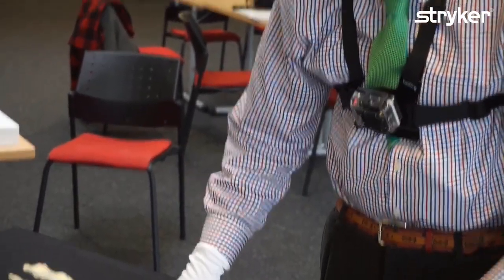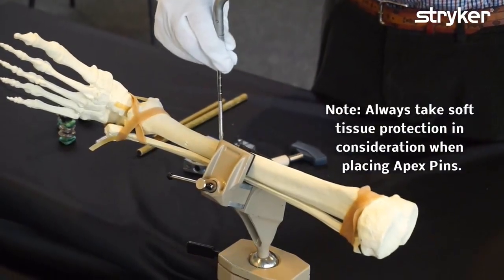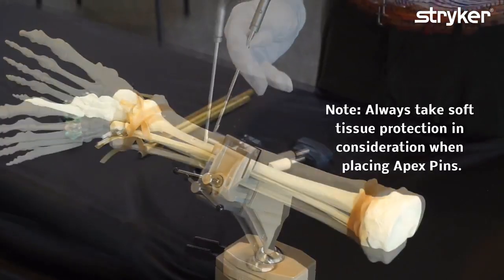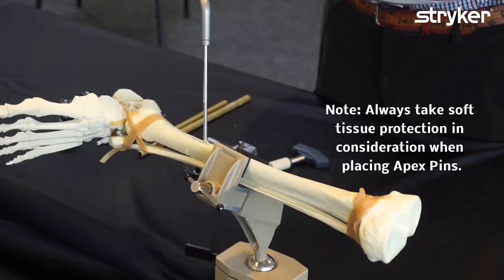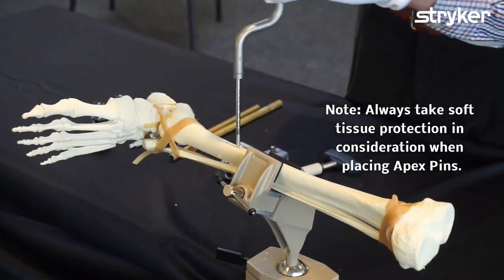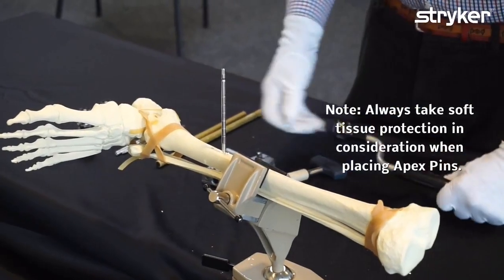Now we're going to install one pin close to the fracture on each side. I believe that pins should always be drilled by hand, not by power. This is the front face of the tibia. A very common mistake is to put the pins too vertically. They should really be angled a little bit so that they pass through the medullary canal — a little bit bent up, but not too much. That's distal to the fracture. Now I'm going to put one pin on the other side.